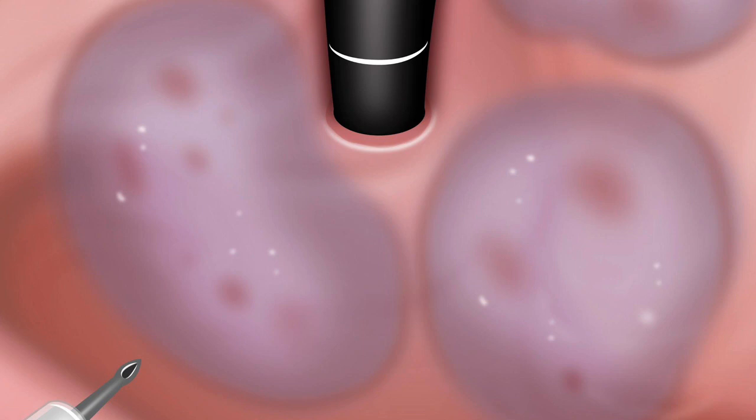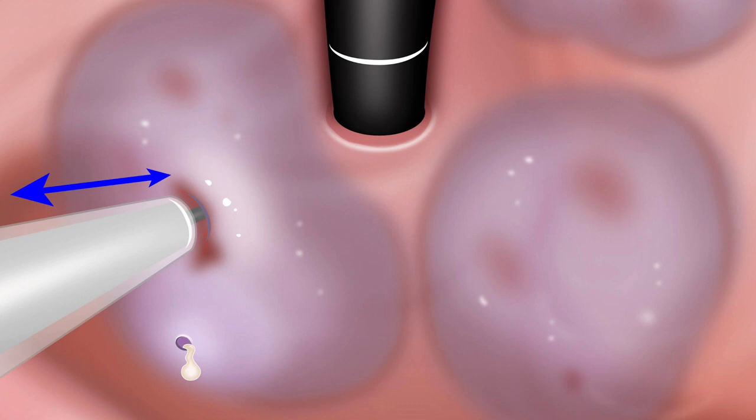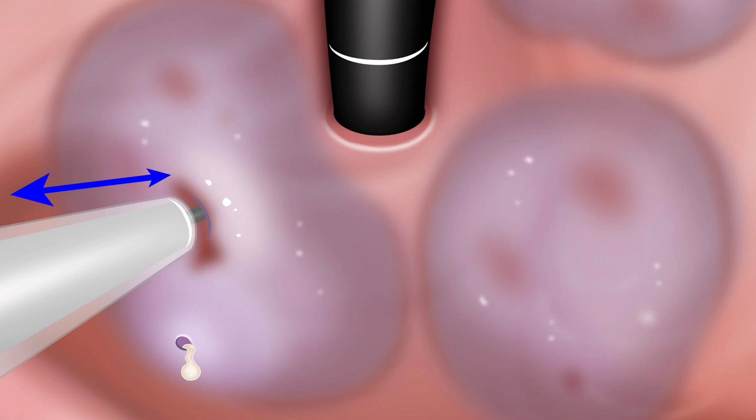Here is a large fundic varix. We all get tempted to go to the mound or the top of the hill, but if you go to the top of the hill you are likely to end up with bleeding. The principle is to start at the bottom of the hill — the periphery of the fundic varix close to the wall — inject first there, and then walk your way up to the top of the hill, jiggling the needle as you inject to prevent it from getting stuck.